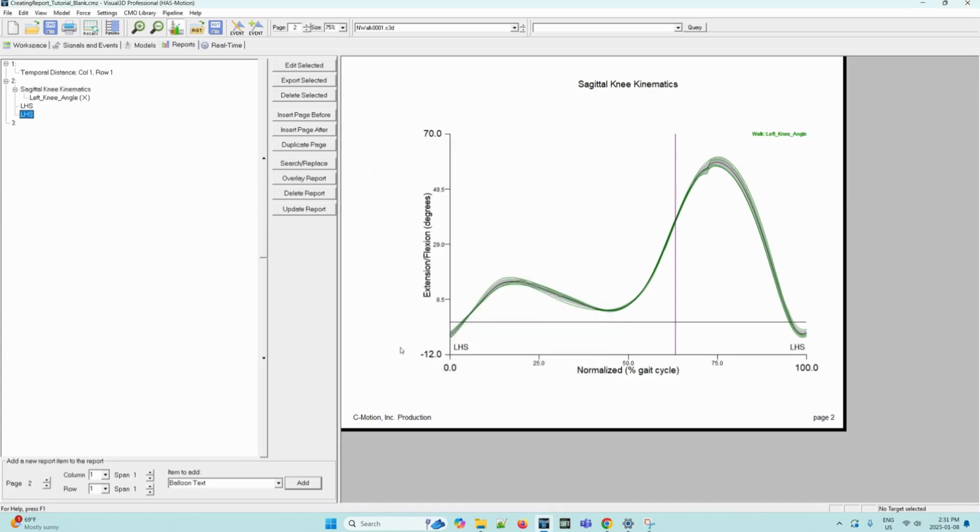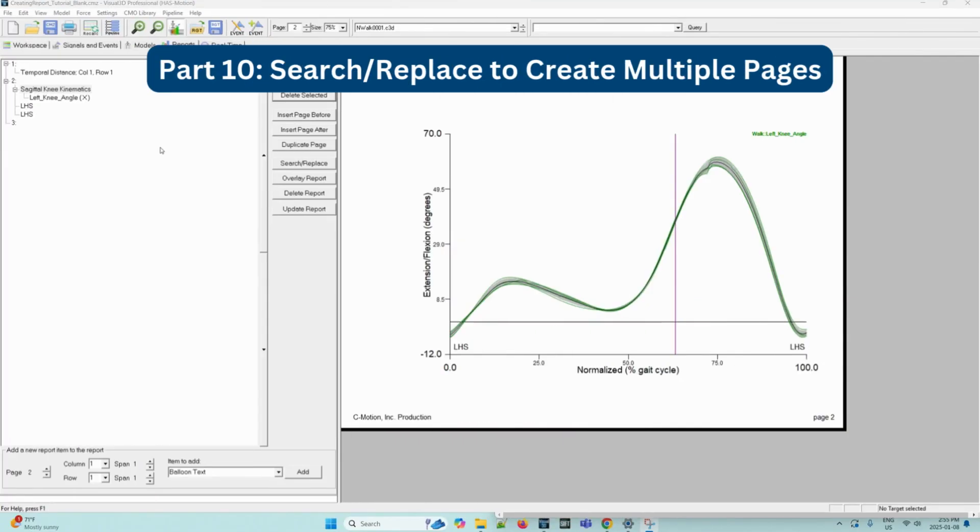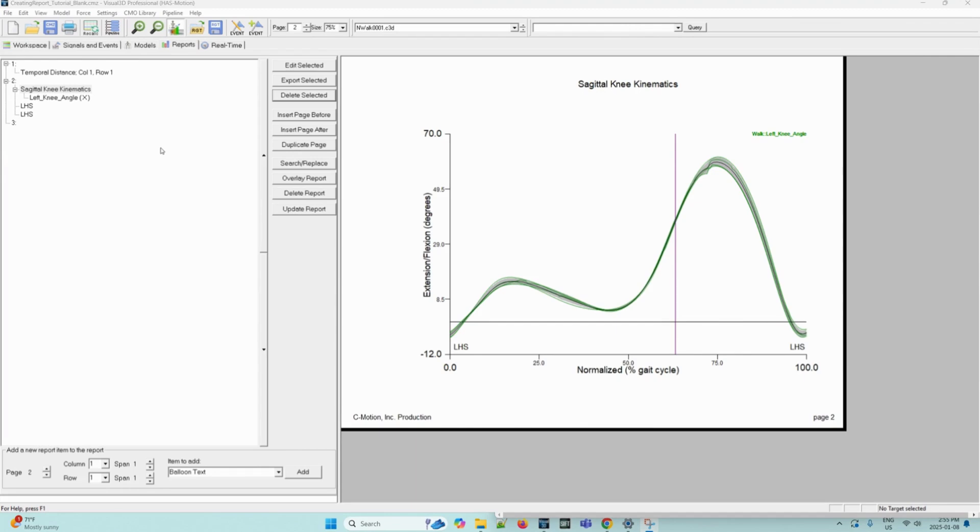Now the text LHS should now appear at 0 and 100% of the X axis as we can see. When creating reports with multiple pages using the same format, but graphing differently tagged items or using different events, it is possible to use the search and replace function to quickly create new pages.